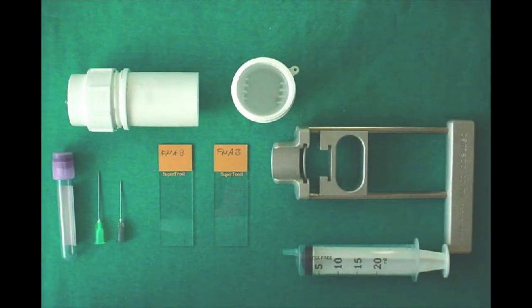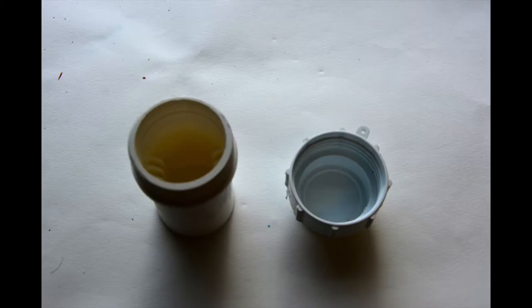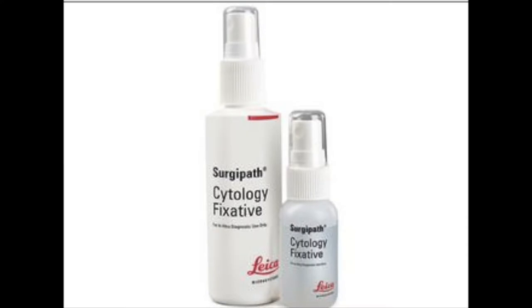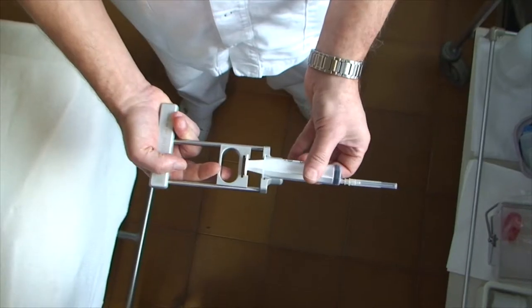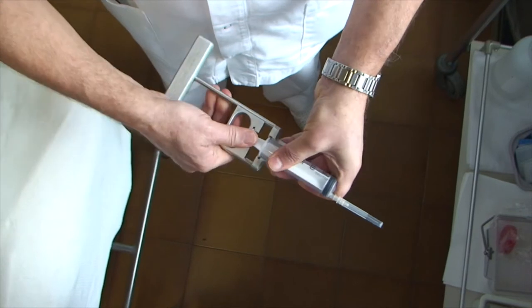The required equipment includes: 1. A 20 ml disposable syringe; 2. A lancet-tipped 22-gauge needle; 3. Three new slides; 4. A plastic container to transfer the specimens; 5. Alcohol at 95% as a fixative fluid or spray; 6. A syringe holder to enable the operator to aspirate the specimen with one hand. The syringe holder is armed and disarmed in this way.